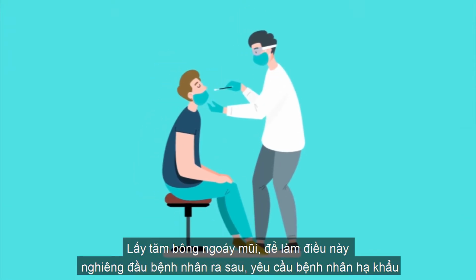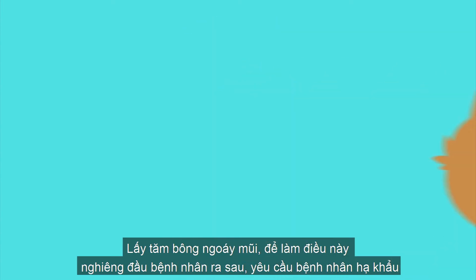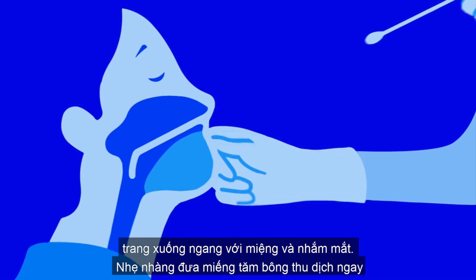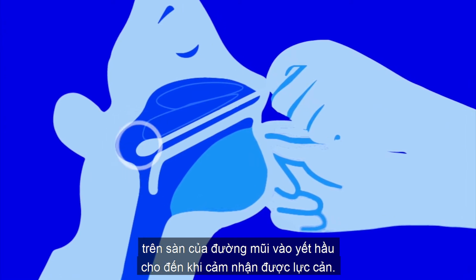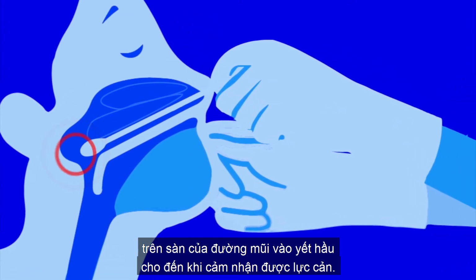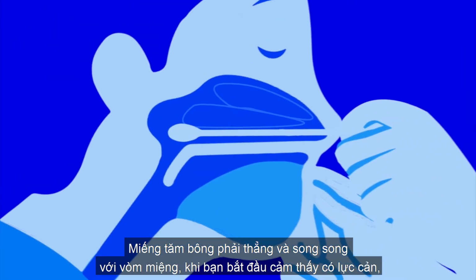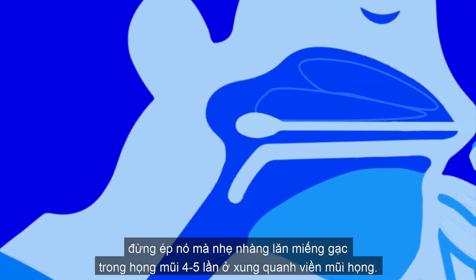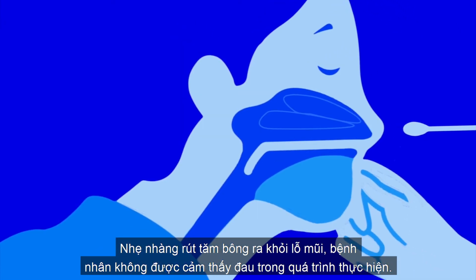Take the nasopharyngeal swab. To do this, tilt the patient's head back, ask him to lower the mask to the level of his mouth and close his eyes. Gently insert the collection swab just above the floor of the nasal passage into the nasal pharynx until resistance is felt. The swab should be straight and parallel to the palate. When you start to feel resistance, do not force it and gently roll the swab in the nasopharynx 4 to 5 times on the wall. Gently pull the swab out of the nostril.